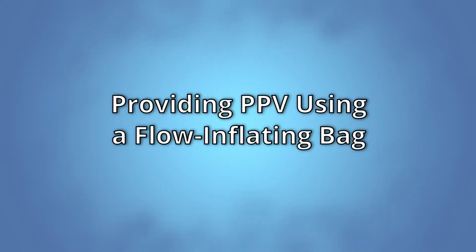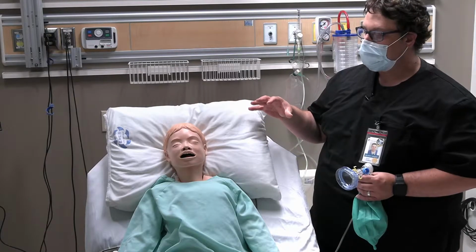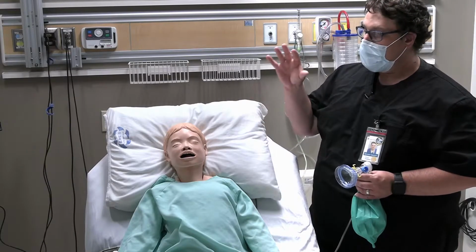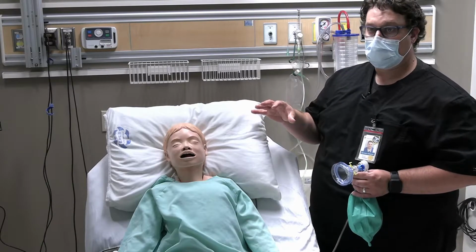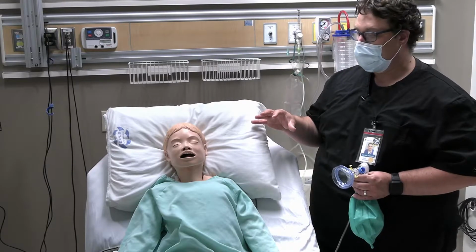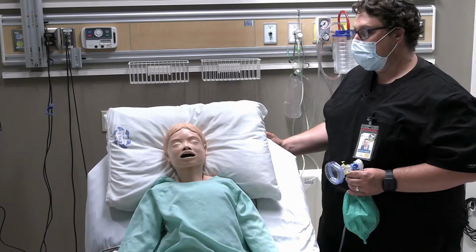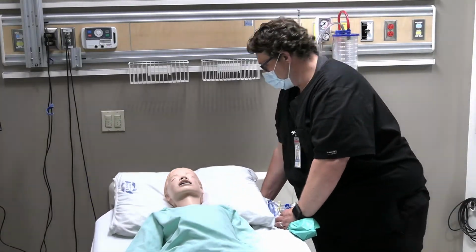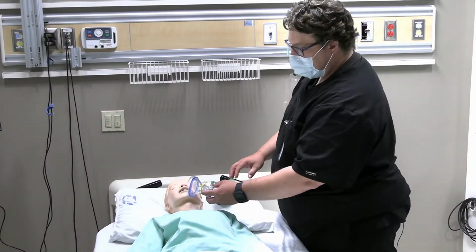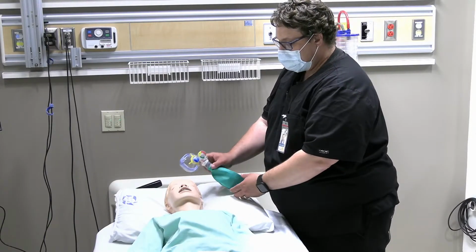Our patient is in respiratory distress, not effectively breathing, and we want to support and assist his respirations. So the biggest thing with bag mask ventilation to make yourself successful is proper patient positioning, okay? So with this patient here, and we're on the stretcher, we're going to drop the head of the bed so that it's flat. Okay, we have our bag nearby. We can actually provide some blow-by oxygen while we're doing this.